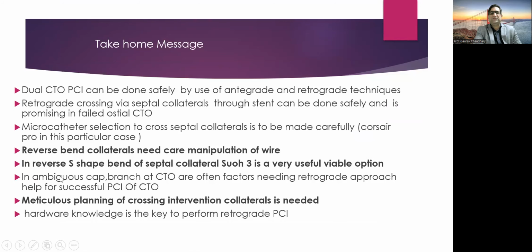So, take home from this case is that many times we can get dual CTO. So, we can deal with the first CTO first, the second afterward. So, in this particular case, antegrade CTO of LAD was done, and we got a stent in the LAD. Then we can, with the newer microcatheters like Corsair Pro XS, which are thin profile, 1.3 French distal tip profile, we can negotiate across the septal, these jailed septals across the stents.